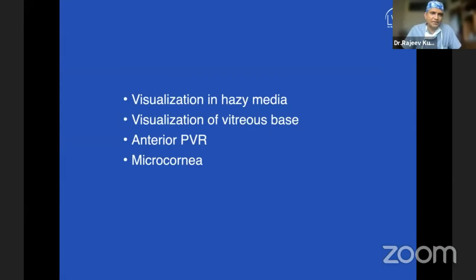That is something which has been taken for granted. Whenever there is a corneal opacity, you can't see, so you will say fine, we'll use an endoscope, we want to see better. Like in endophthalmitis, or like what Vivek had shown, or Mudit was showing, cases with too much corneal scarring. But other than this, I will touch upon the other three factors, in cases where we still encounter retinal detachments and use the endoscope as an adjunct rather than only the endoscope to do a vitrectomy.